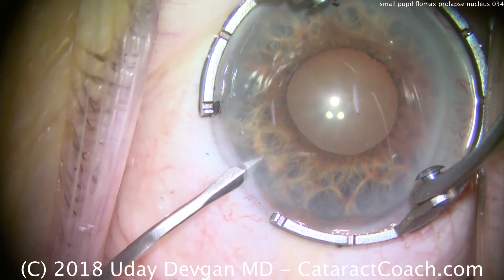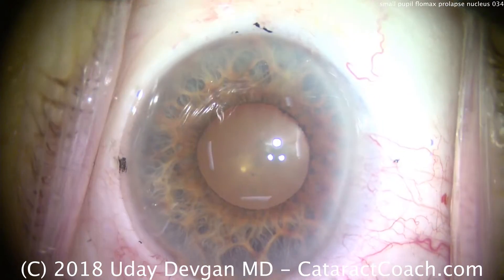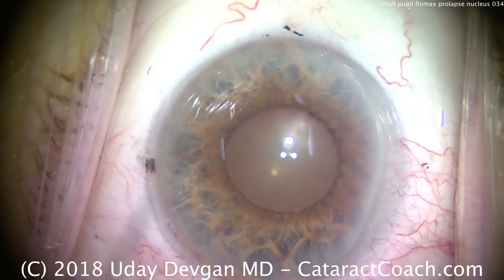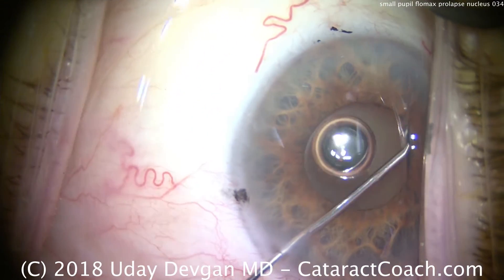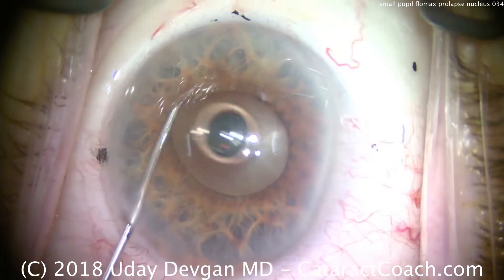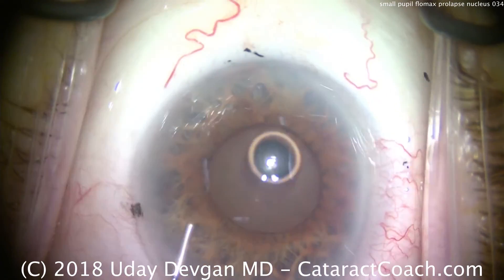Cataract coach with a case of cataract surgery in a patient with a small pupil. The patient is elderly, 88 years old, the pupil is small. It's a small eye — the patient is going to get a 25-diopter lens, and it's a small white-to-white.